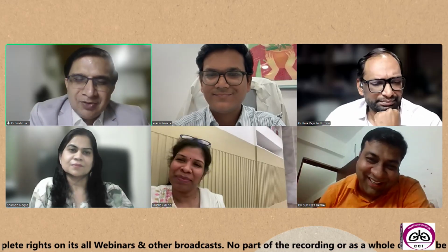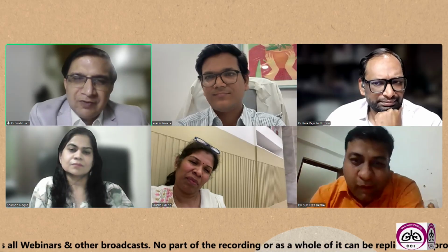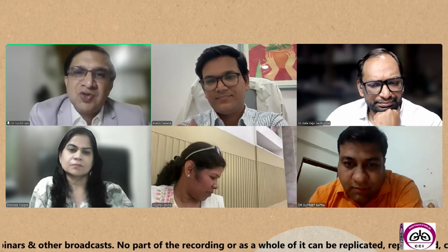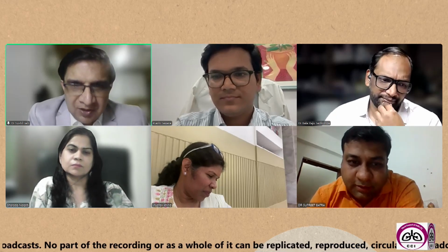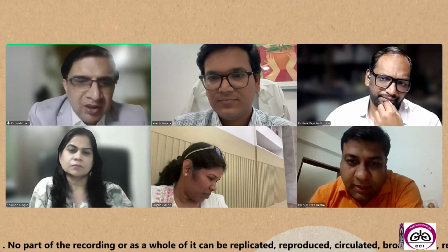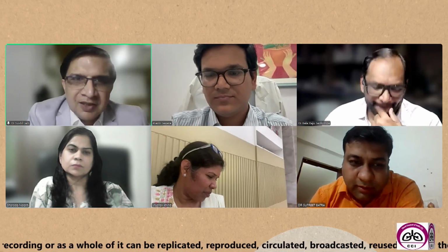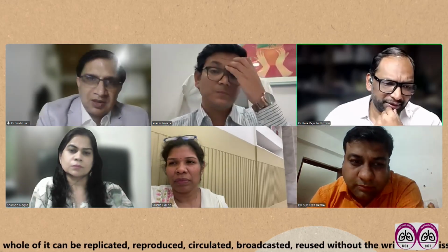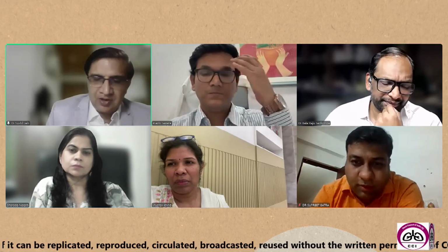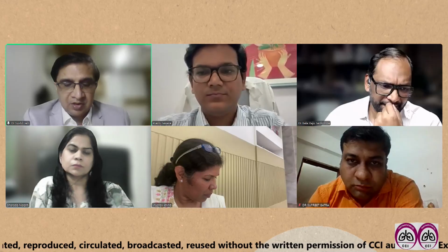Probably we will stick to the routine EBUS TBNA, and if your ROSE is negative, or if you're not getting enough tissue, or you're suspecting sarcoid or lymphoma, maybe we can consider doing a cryo. Otherwise, your routine EBUS TBNA is usually enough. I think all the panelists agree with that. Yes, even I don't do an upfront cryo. It's always after an EBUS. Okay, thank you. And now we move on to our next question.